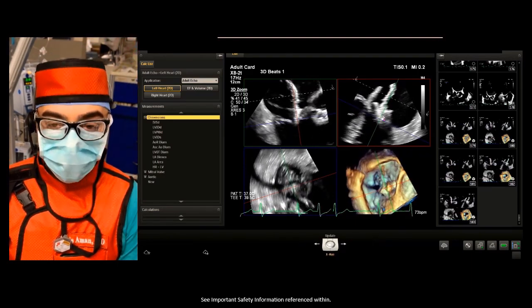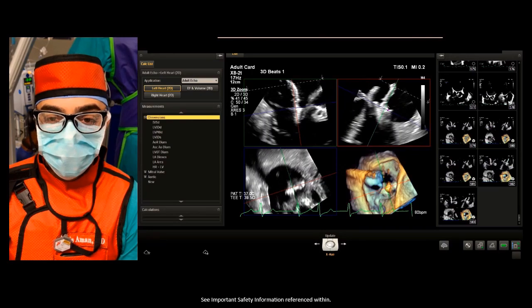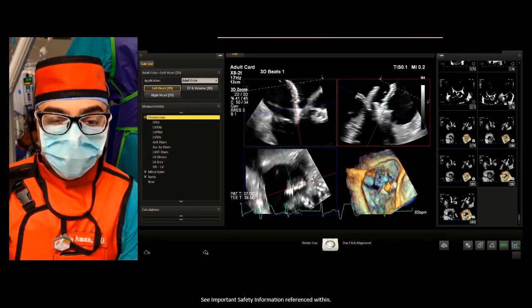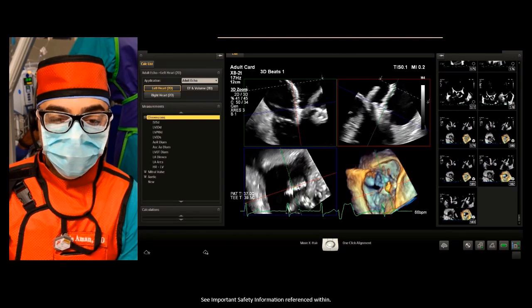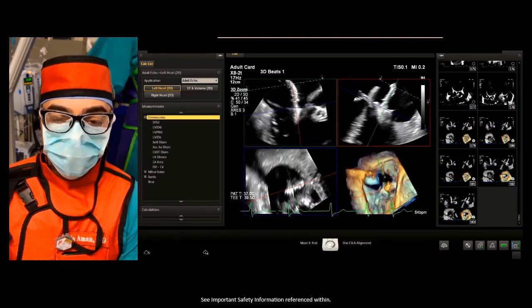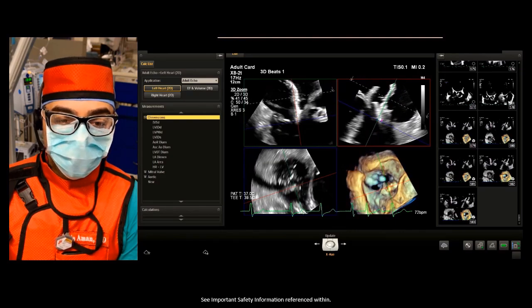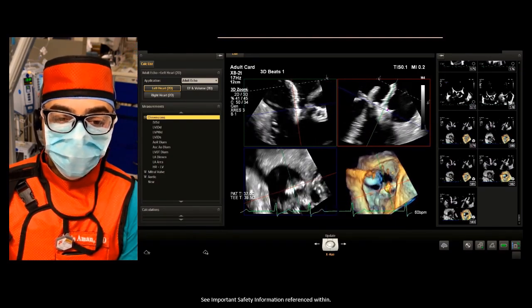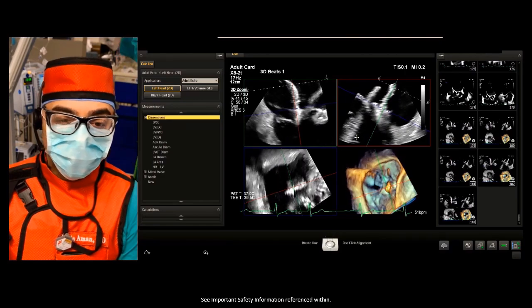So you just merely left click here. After you left click, you move the blue plane up to the clip arms. And now you can kind of see here in the blue plane, that's actually your clip alignment, right? And if you're interested, you'd say like, okay, well, that's what my clip alignment is. Let me go back to the leaflets very quickly. And do I feel like that's a good alignment? So really, Gagan, it's up to you in that way. So what do you feel about this clip alignment? I think it looks really good.